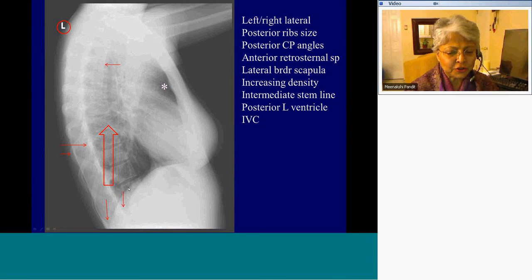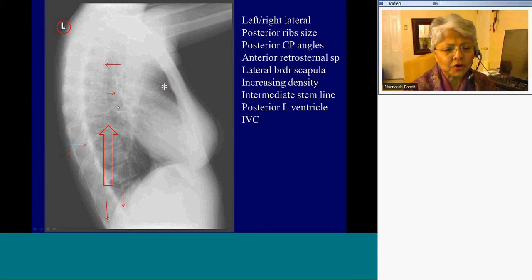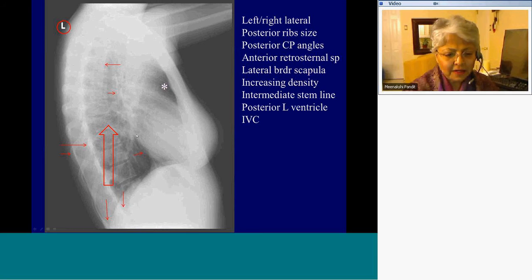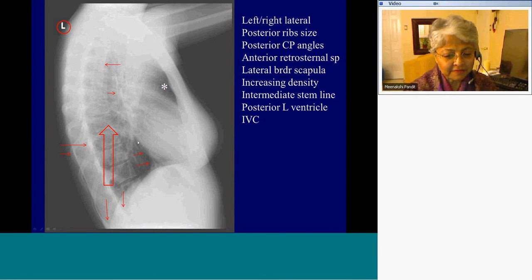As a result of the scapulae and parascapular muscles, as you cross from the diaphragms to the upper lungs, there is a gradual increase in radiodensity. This line is caused by the posterior border of the bronchus intermedius — keep this in mind in case you're dealing with right hilar pathology. This is the interface caused by the posterior margin of the left ventricle, and this is the margin caused by the posterior margin of the IVC. The left ventricle is in the left hemithorax, and the IVC margin is in the right hemithorax.